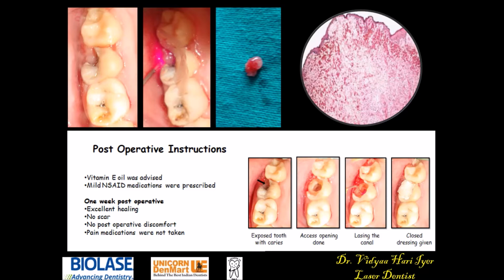And in addition to the root canal, we could use even root canal laser, the kind of irradiation as we call it. So in lasers, in endodontics or in root canal therapy, we use it in 3 different ways. So this is just one of the ways of using the laser.